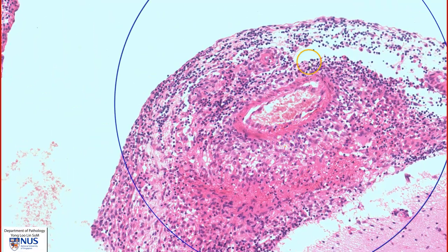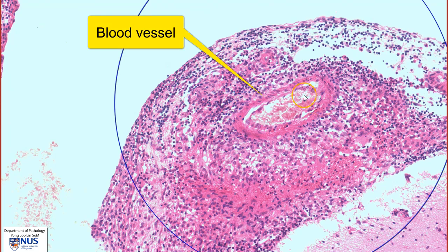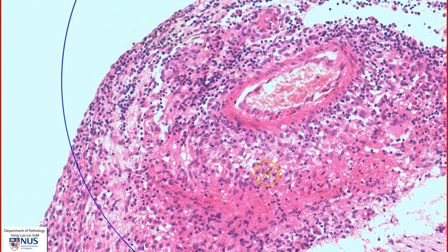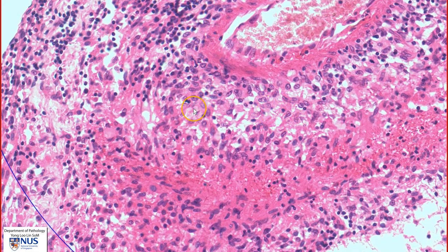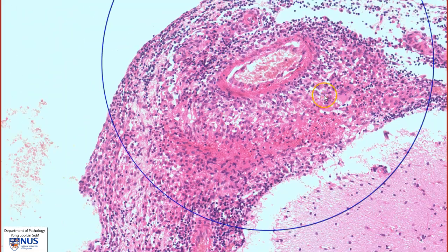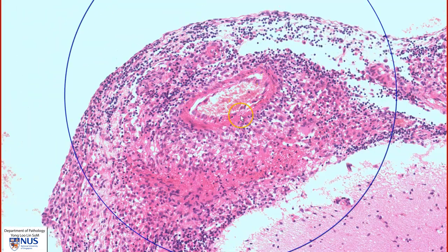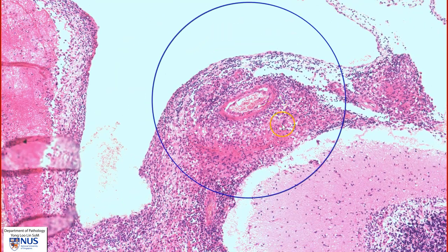This is an area where the granulomatous inflammation is seen around a blood vessel, with a central blood vessel here. We have this area of necrosis and lots of epithelioid histiocytes forming the granuloma. For this reason, the blood vessels can undergo fibrinoid necrosis as well as thrombosis, and this can lead to infarction of the area of supply in the brain parenchyma.